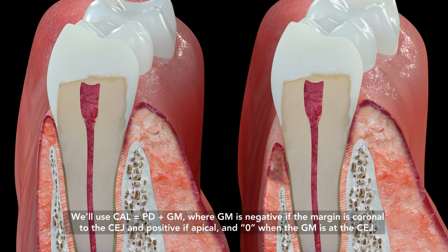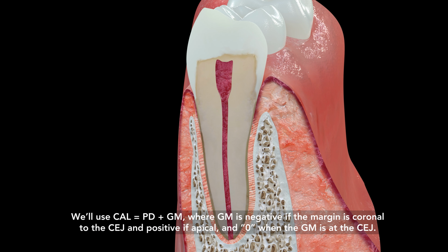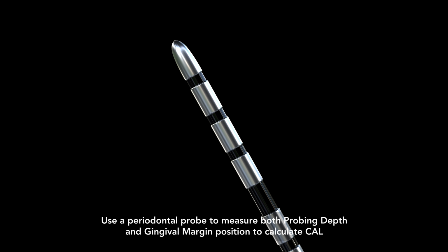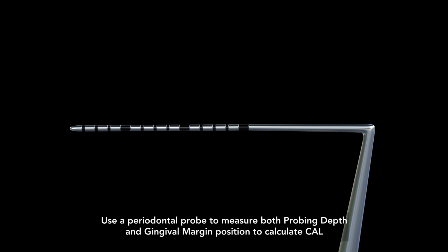We'll use clinical attachment level to equal probing depth plus gingival margin, where the gingival margin is negative if the margin is coronal to the CEJ and positive if apical. It is 0 when the gingival margin is at the CEJ. Use a periodontal probe to measure both probing depth and gingival margin position to calculate clinical attachment level.